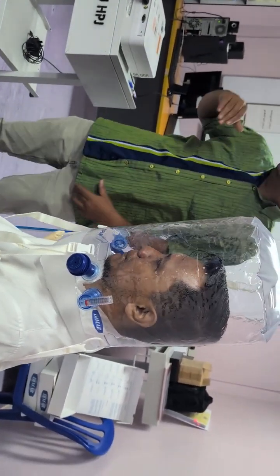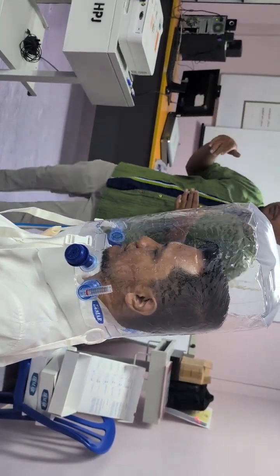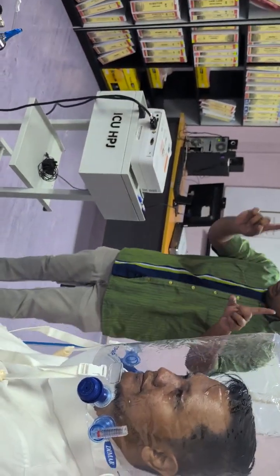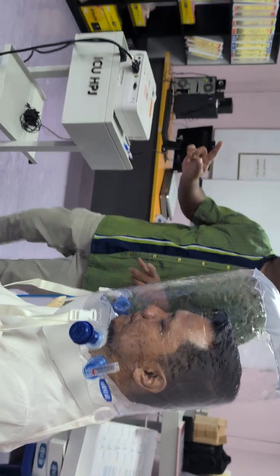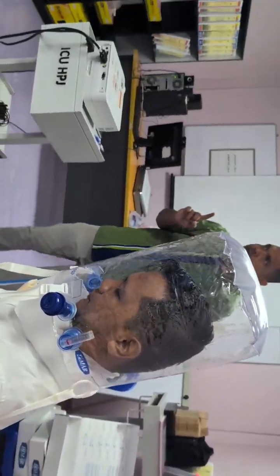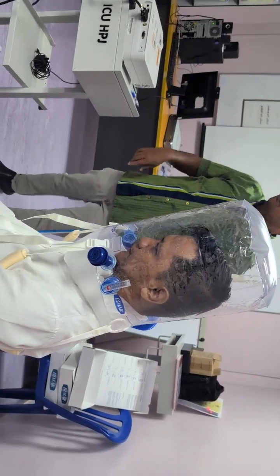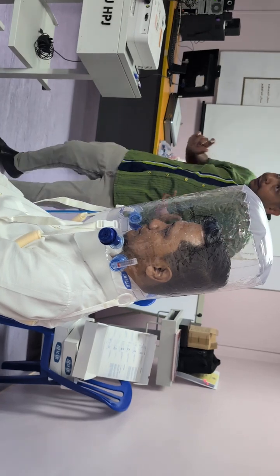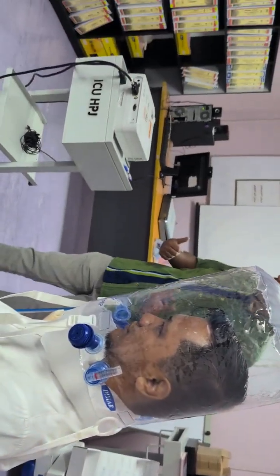Okay, the difference between that mask and this mask is just a different interface. This is more comfortable. When I first brought this in the year 2013, I remember I was the first guy to say I'm not going to sell this, because we have been telling our children don't put plastic bag over your head, and now I'm telling you put plastic bag over your head.